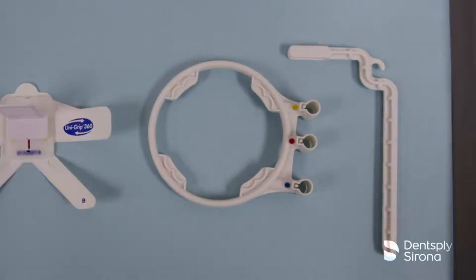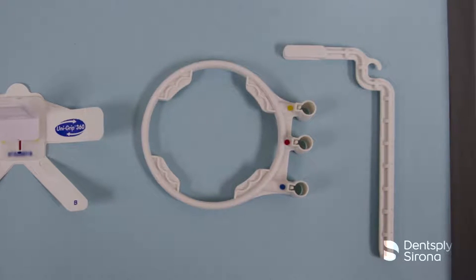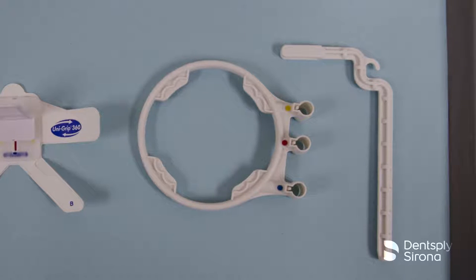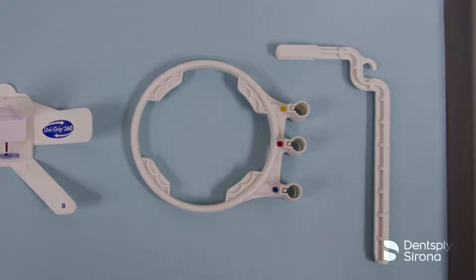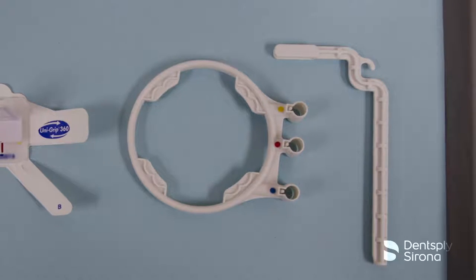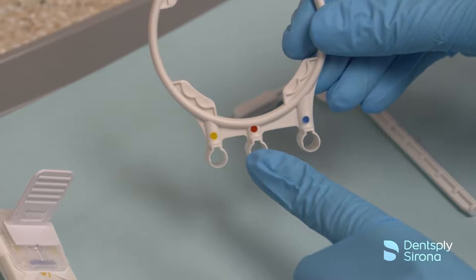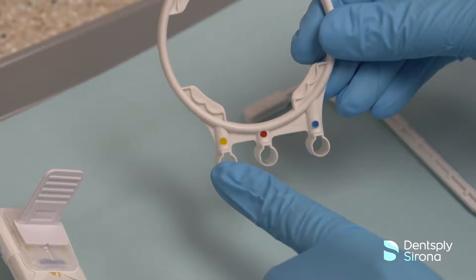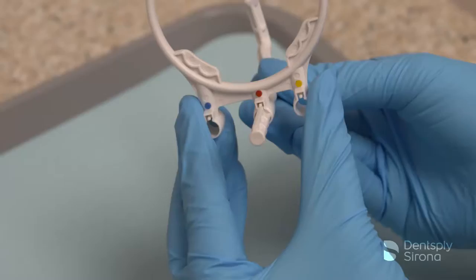The UniGrip positioning arm and ring can be utilized with the UniGrip 360 Sensor Universal Holder. The positioning arm and ring is color-coded for quick assembly to align with the image being captured. The color coding of the UniGrip 360 holder is the same as the original RIN XCP system: blue for anterior, yellow for posterior, and red for bitewing.